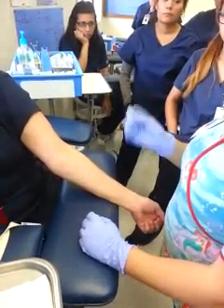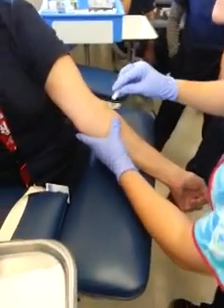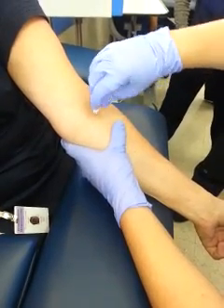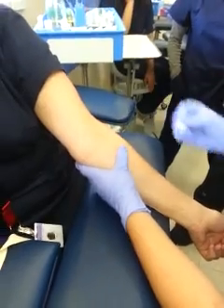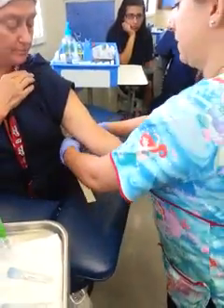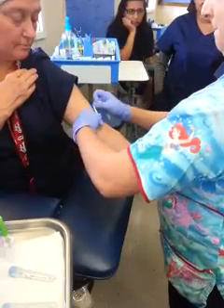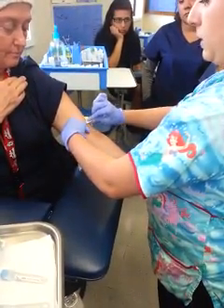If you need to make a mark, you can use the clear plastic side of the needle and just go in a circular motion of where you're going to insert. The indentation hurts a little bit, so make sure to check on your patient. You can see the indentation of where you're going. Then reapply the tourniquet nice and tight so we can see the vein as prominent as possible.